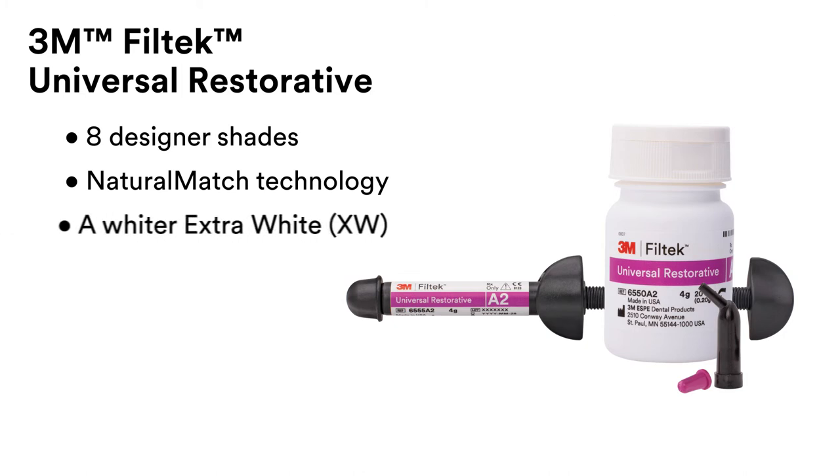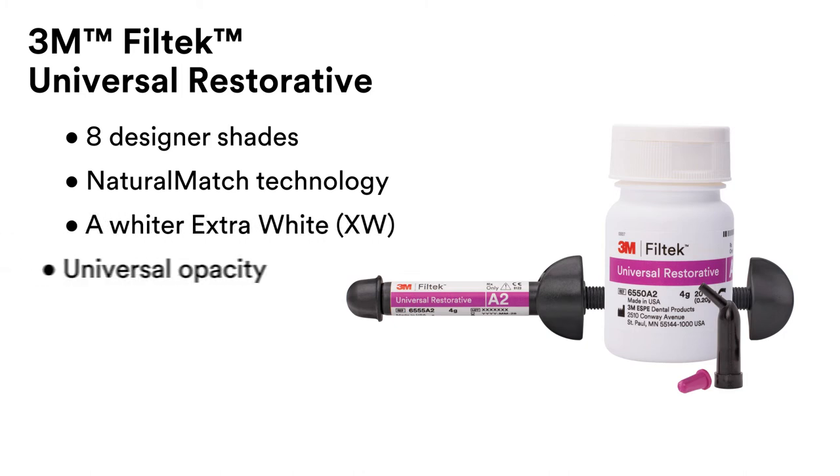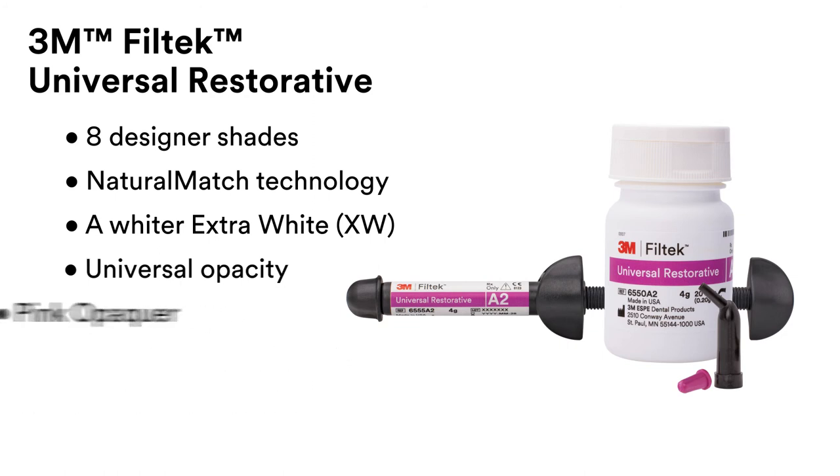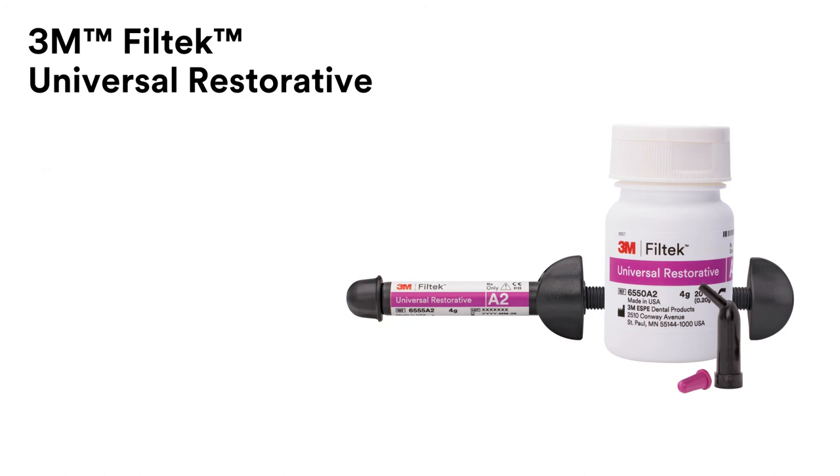3M Filtek Universal Restorative simplifies single-shade restorations with 8 designer shades and Natural Match Technology, a whiter extra white, universal opacity, pink opaquer, an easy lasting polish, and low shrinkage stress. 3M Filtek Universal Restorative — universally simpler.